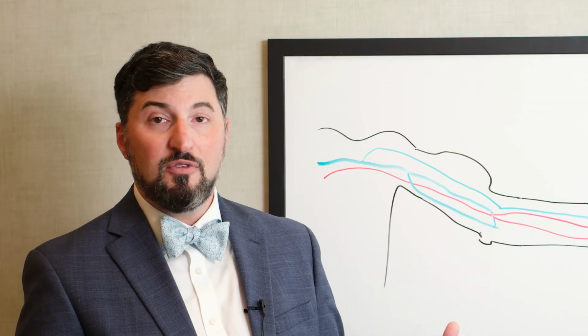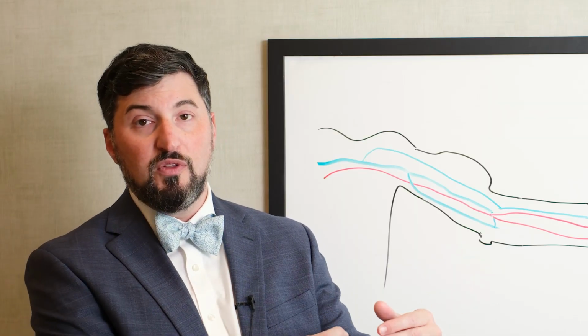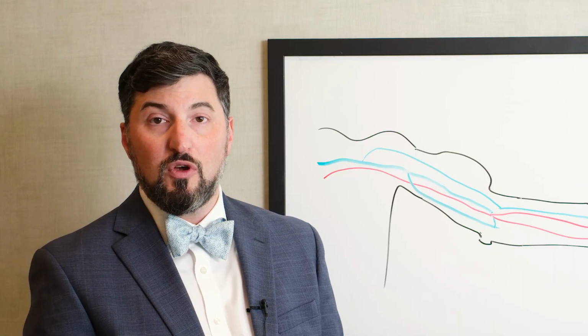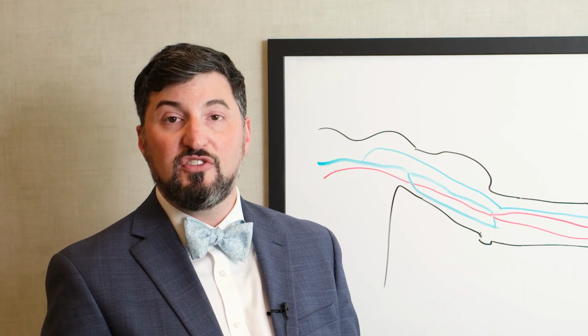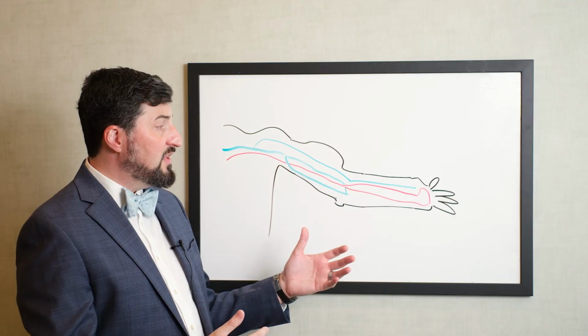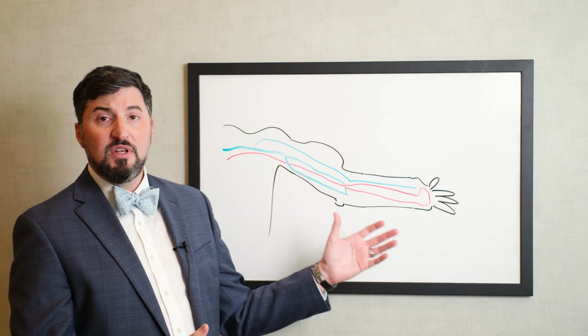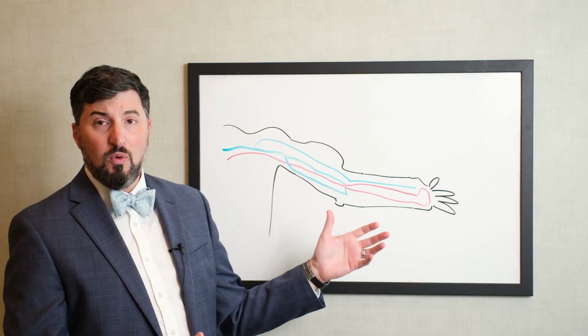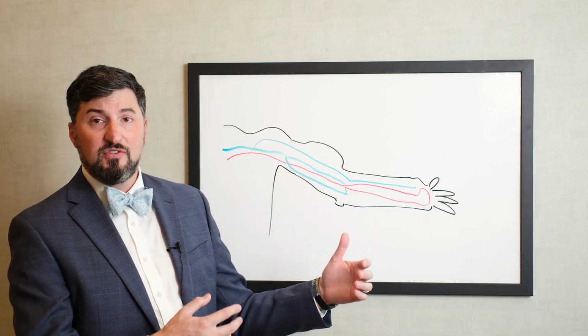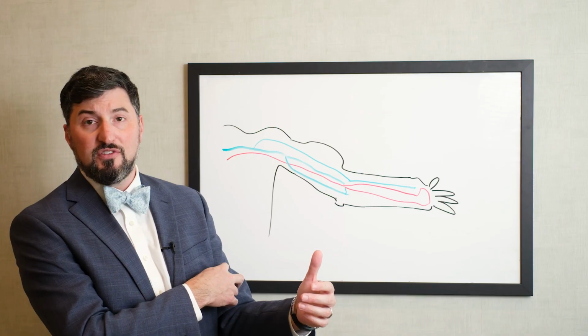If, God forbid, it shuts down, not the end of the world. We can usually go in with 2 small needle pokes, get all the clot out of it, balloon or treat whatever the causative lesion is, or whatever's causing that thing to shut down, fix that problem and get the graft up and running. Long and short of it is, you need a vein, you need an artery, and we need to make a connection. We need the vein or something to replace the vein, in this case a graft, to be able to provide an access for them to access with 2 needles for dialysis.